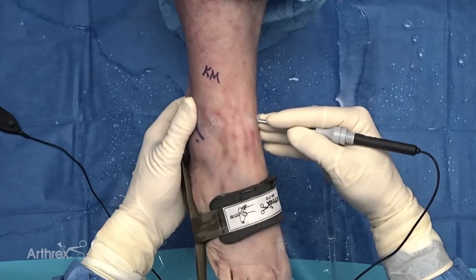For my typical ankle instability, I'll stop and do a talar tilt during the case. Watching this dynamic examination reiterates my diagnosis — by watching the talar tilt, I can appreciate that the ankle is unstable, then complement that by looking in the lateral gutter to see if I have a patulous lateral capsule, thus indicating a repair of the lateral ligaments.